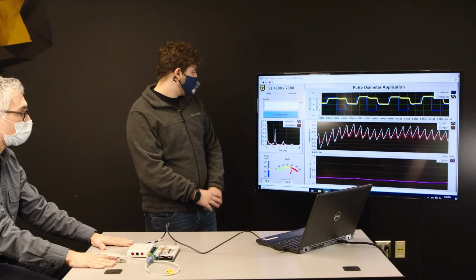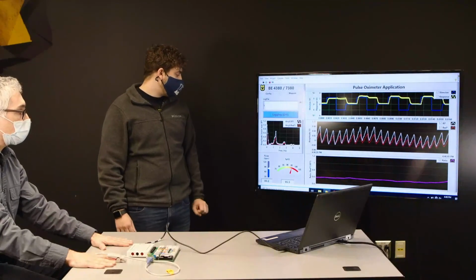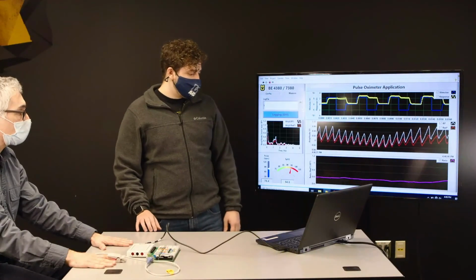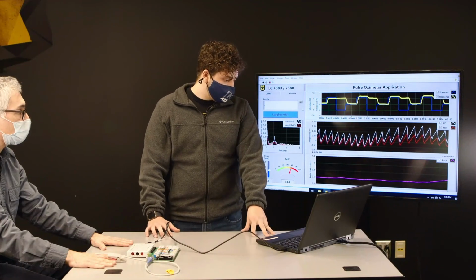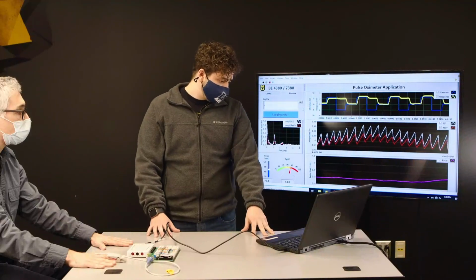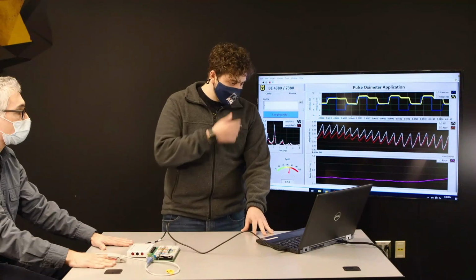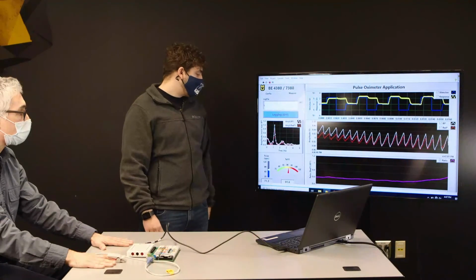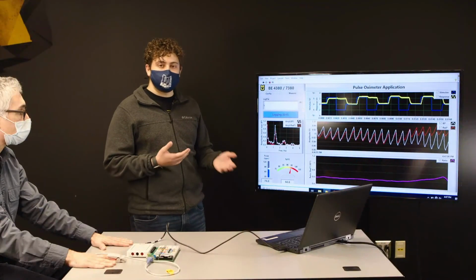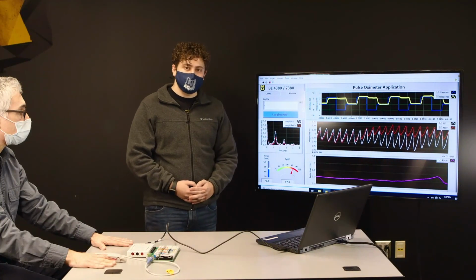And as such, it's going to change that blood oxygen level. Yeah, so here we can start seeing it become more drastic. And we see it decreasing, so it was at 96. Now it's going down to 95. And keeps going down. Yeah, so now it's under 95%, which, in most cases, under 95% could indicate that there's some type of issue that you would need to check, and it could be related to respiratory.